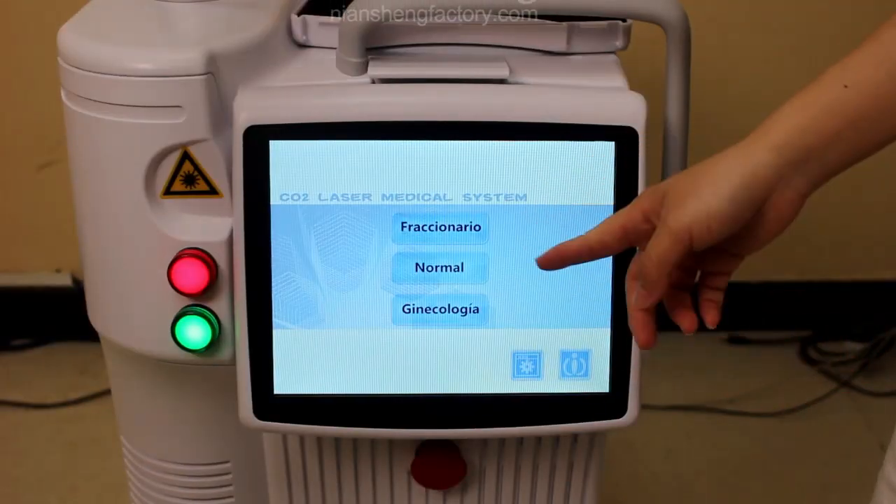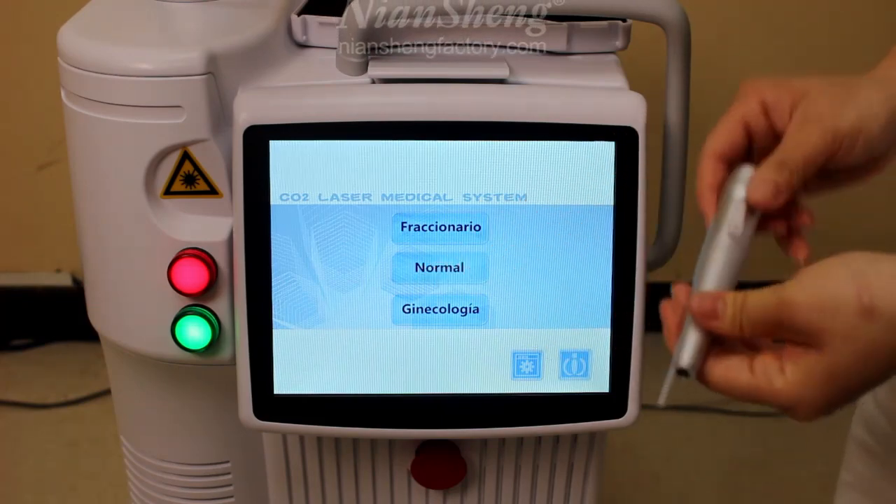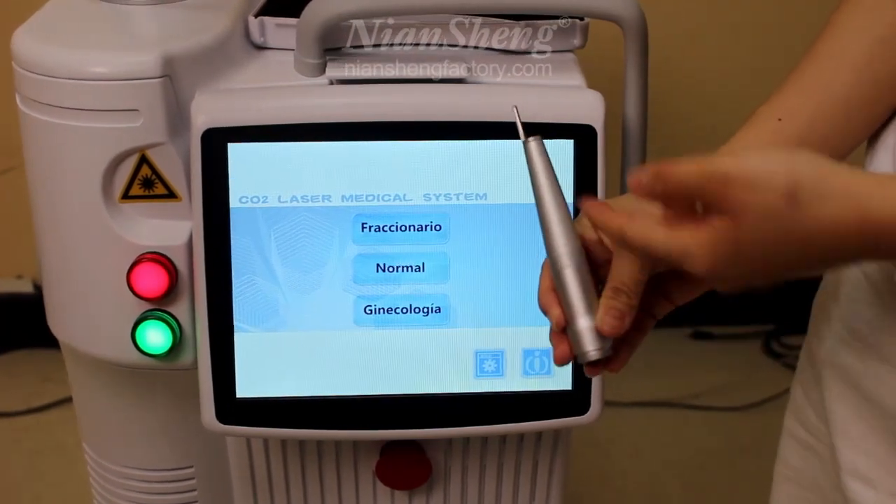Now let's enter the next interface — the Normal mode, which means we use this for routine treatments.